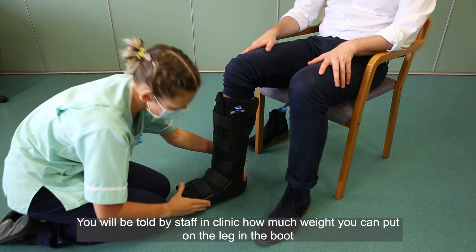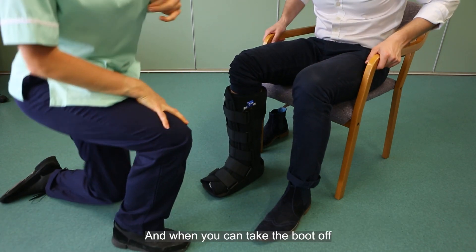You will be told by staff in clinic how much weight you can put on the leg in the boot and when you can take the boot off.